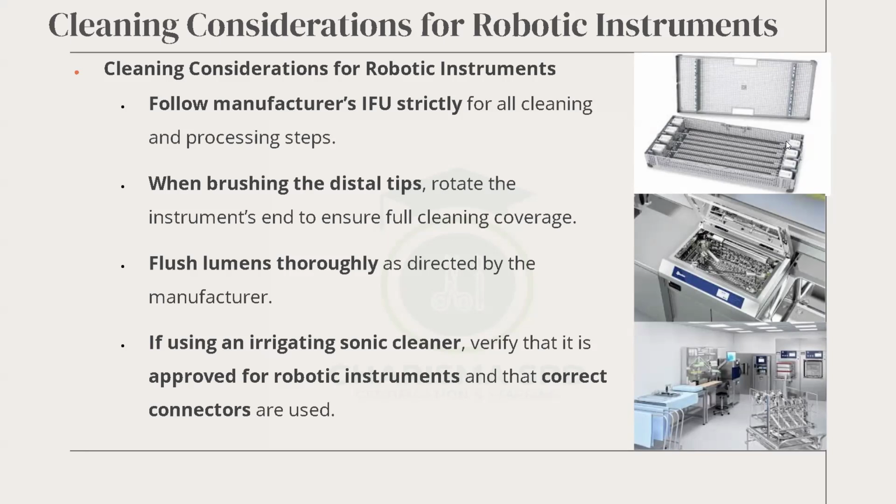The picture underneath is the sonic machine that cleans these robotic arms. You soak them, get the tips clean of debris or bioburden, and then you connect them in the machine to clean and disinfect. In some cases, once the machine does its job, it's good to go. All you need to do is assemble it and get it sterilized. In other places, beyond the robotic sonic machine doing its job, you still have to pass it through the wash.